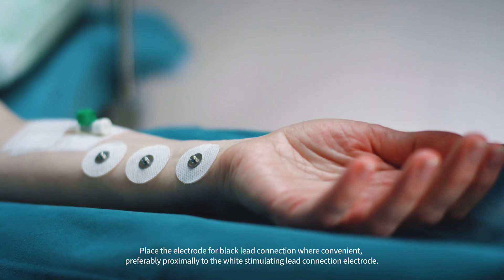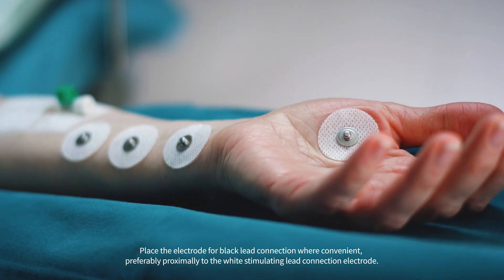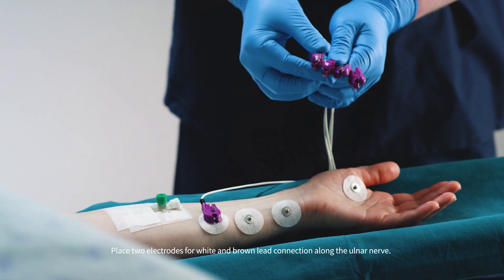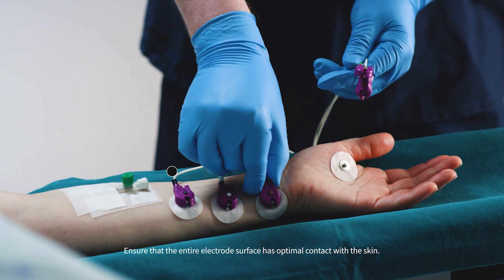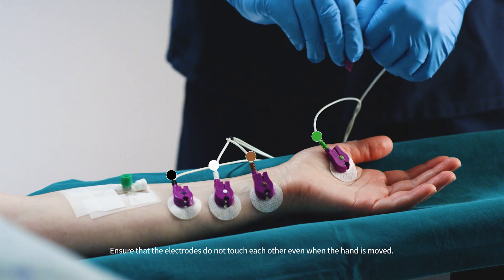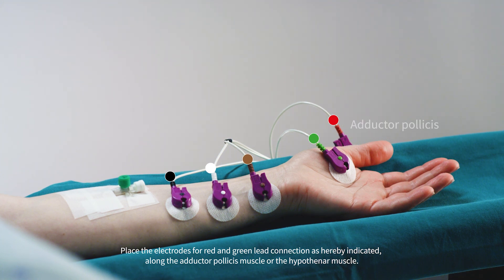Place the electrode for black lead connection where convenient, preferably proximally to the white stimulating lead connection electrode. Place two electrodes for white and brown lead connection along the ulnar nerve. Ensure that the entire electrode surface has optimal contact with the skin, and ensure that the electrodes do not touch each other even when the hand is moved. Place the electrodes for red and green lead connection as indicated along the adductor pollicis muscle or the hypothenar muscle.